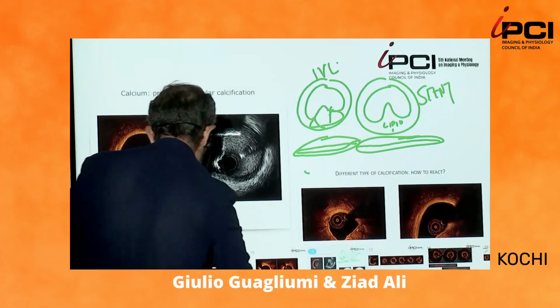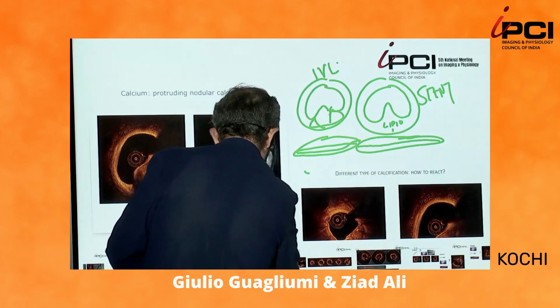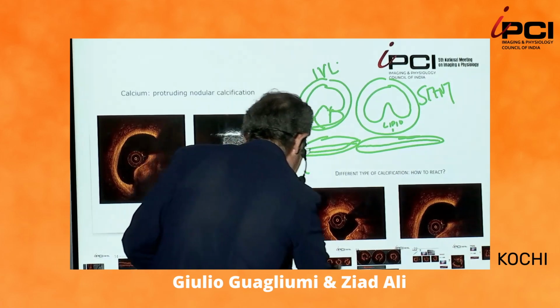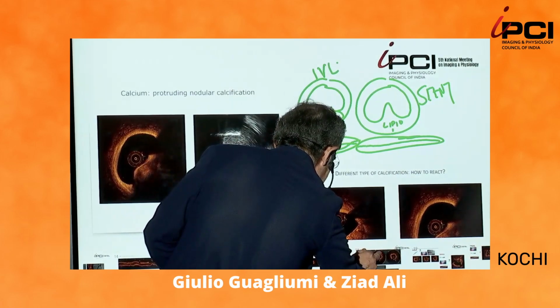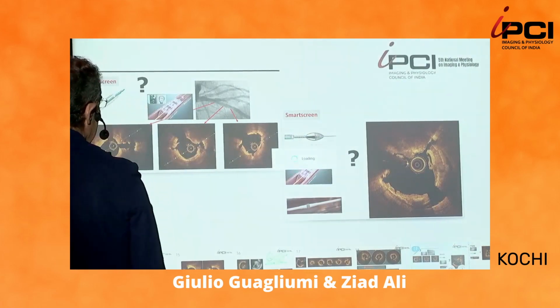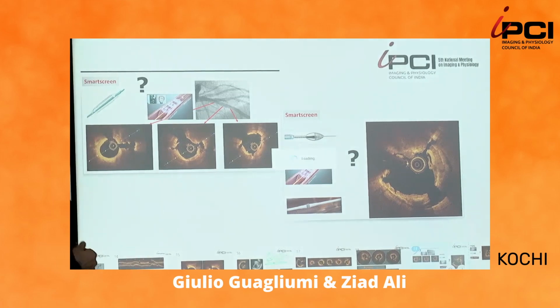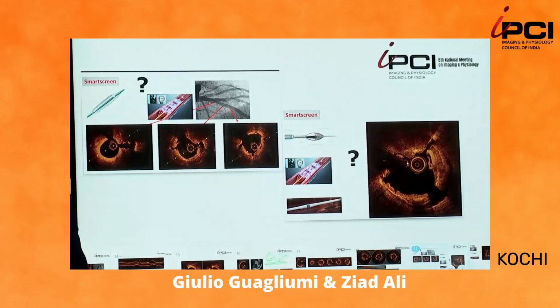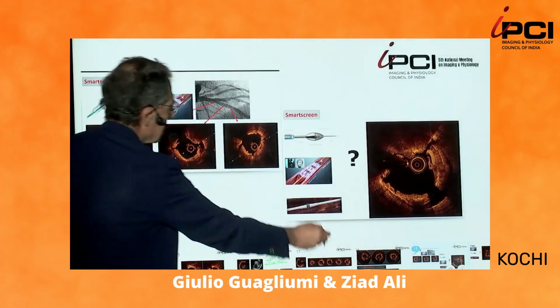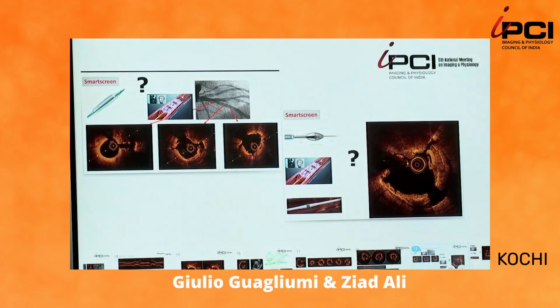Okay, as you are seeing, we are moving from morphology to the treatment. Let's have some idea here. How did we achieve this? You have different types of devices.